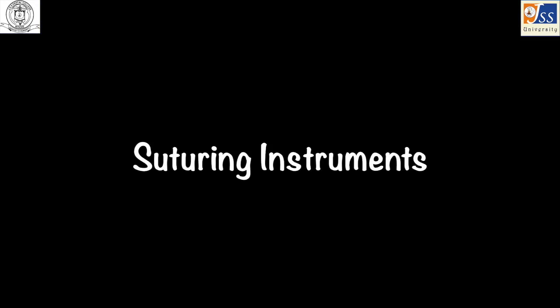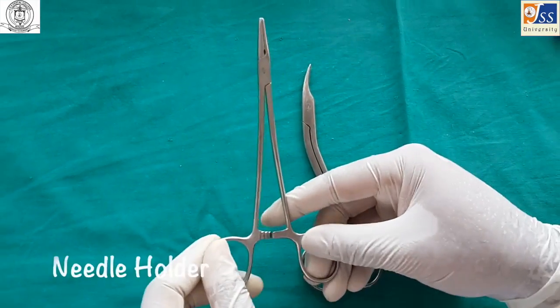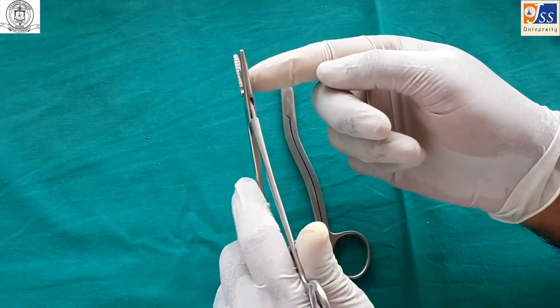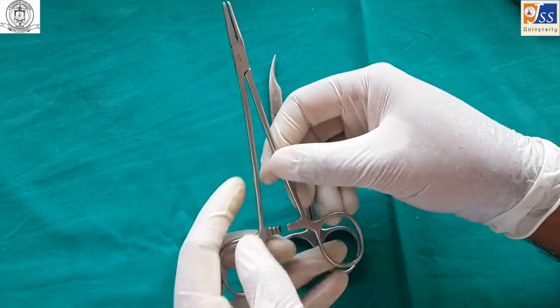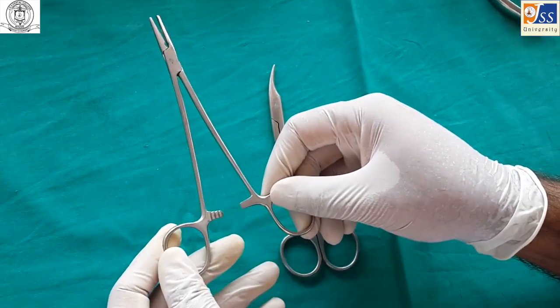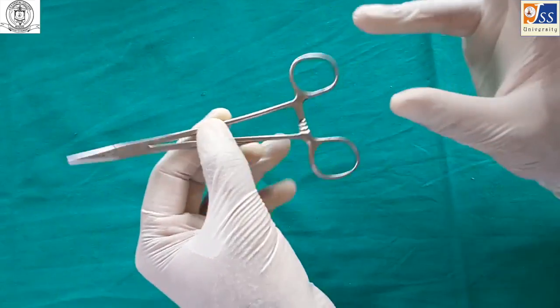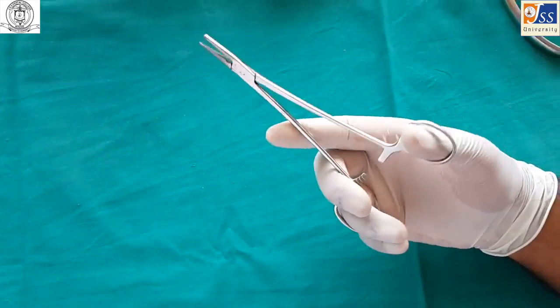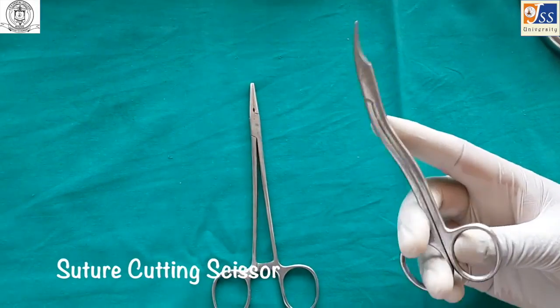Suturing instruments consist of a needle holder and scissors. The needle holder is identified by criss-cross striations on the inside; it is a latched instrument, held with the thumb and ring finger, with the middle finger for support and the forefinger for direction. A suture cutting scissor is used after suturing and for removal of sutures.